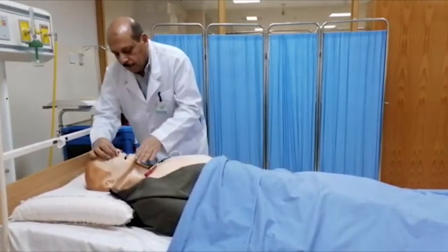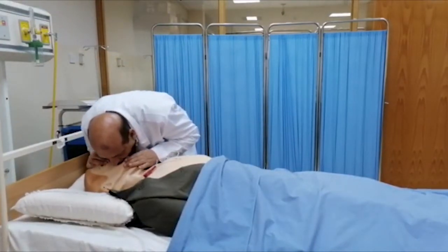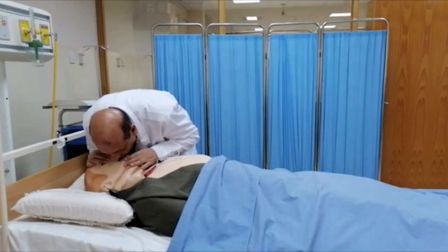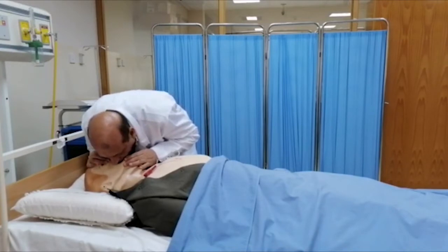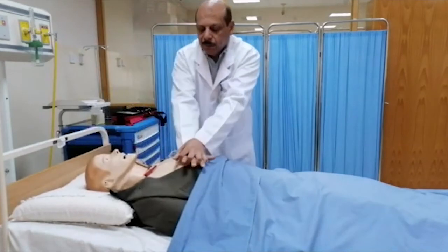Tilt head, lift chin, and give two full breaths. Breathe. Continue with compressions.